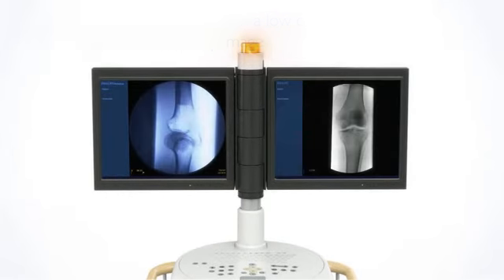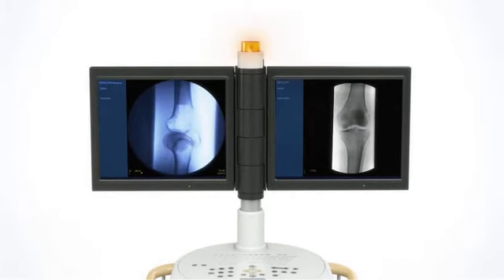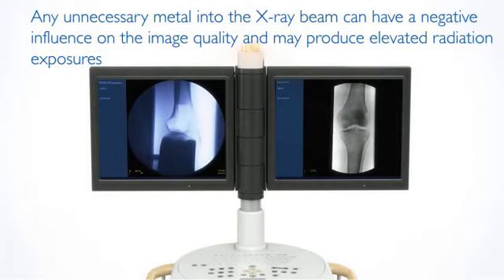The part of the body being examined has to be positioned on a metal-free area of the table. Introduction of any unnecessary metal into the X-ray beam can have a negative influence on the image quality and may produce elevated radiation exposures.